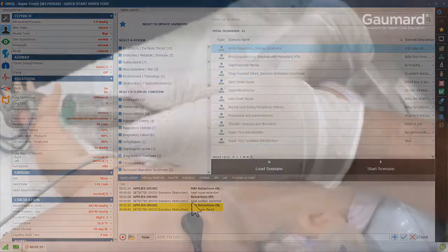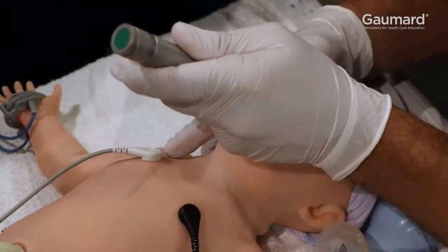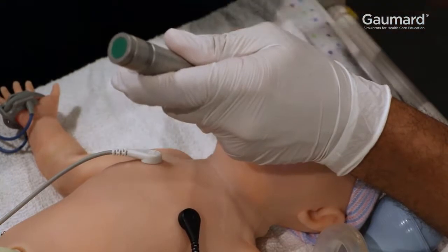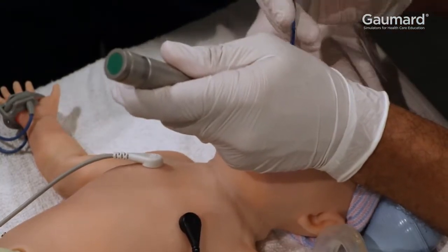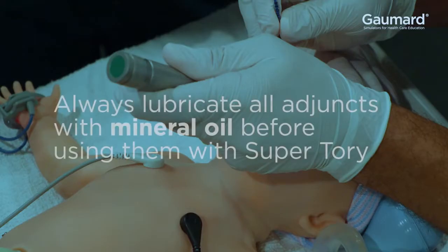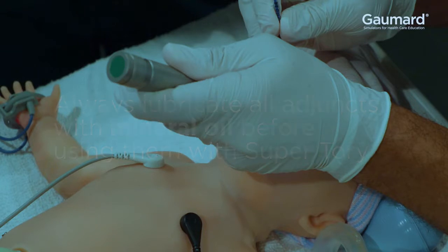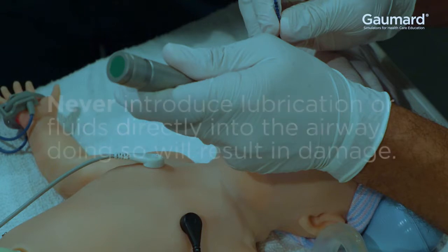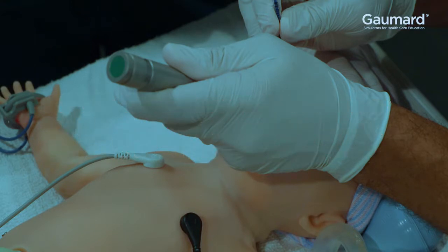Supratory's airway supports standard adjuncts. Size 3 and 3.5 endotracheal tubes work best with Supratory. Always remember to lubricate any instrument before use. Never introduce fluids or lubrication directly into the airway, as doing so will result in damage.